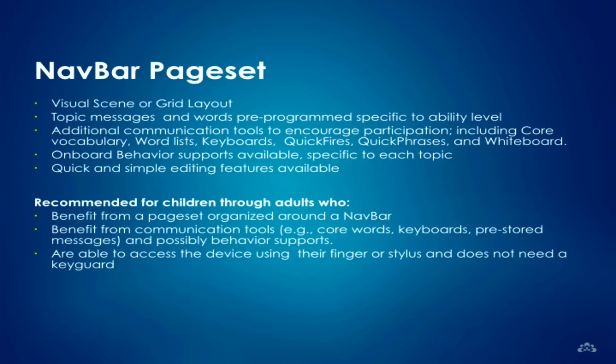So we've just looked at the Navbar page set, and I've just got a quick page that gives an overview of some of the features of that page set, as well as who that might be recommended for, from children through to adults. So one of the key things is that that particular page set is organised around that scrolling navbar, so anyone who could benefit from that, as well as the different communication tools that I mentioned: the core words, keyboards, and those pre-stored messages, and according to that visual scene or grid layout, and also those behaviour supports. And then one of the main things is the access method.